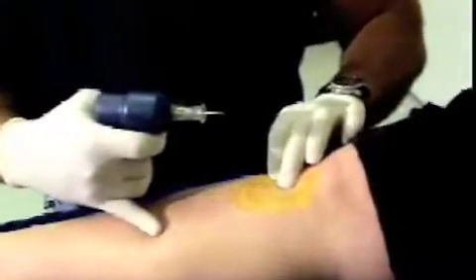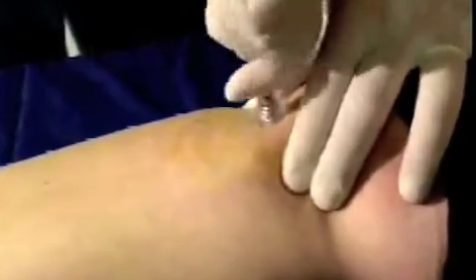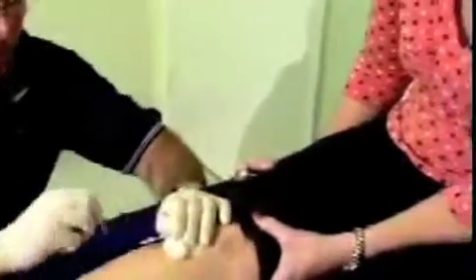Okay. You ready? Yep. We're in. Wasn't bad. A lot of pressure. I'm removing. I can see blood now filling up the catheter there. Okay, I'm going to stabilize her leg. I'm going to turn and lift. And here it comes. It's coming out. There we go. We're out. Does that hurt, Yvonne? No, maybe a 1. A 1, that was it. That's it. Yvonne, you've joined this great club. The club of people who have been drilled by the IO while awake and don't even need it.